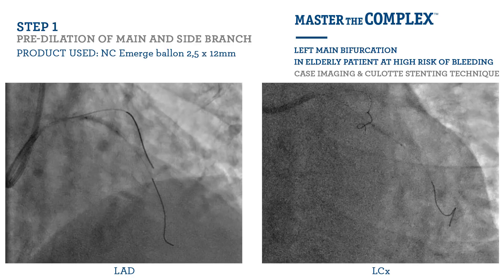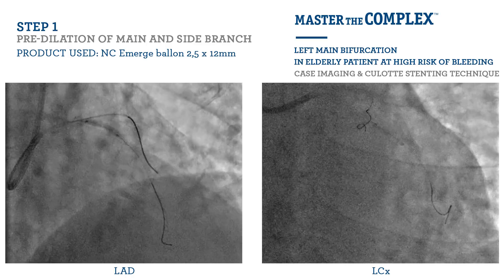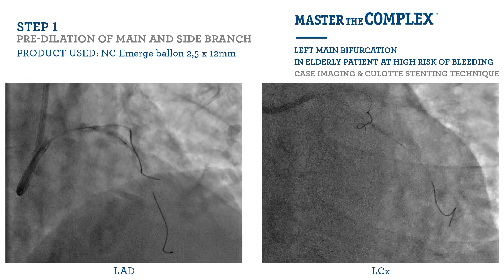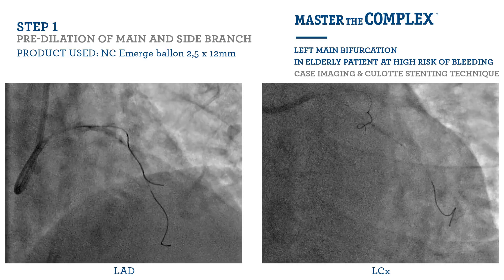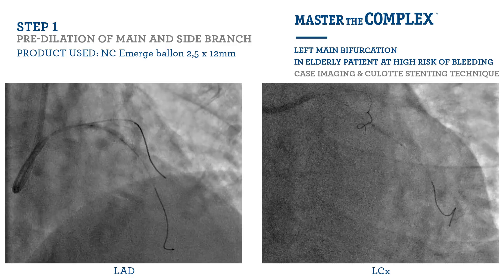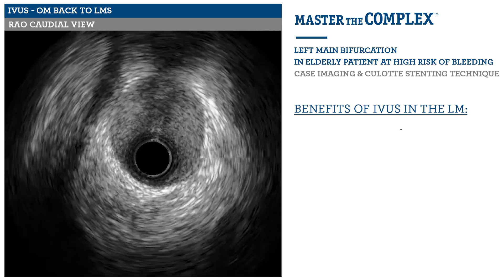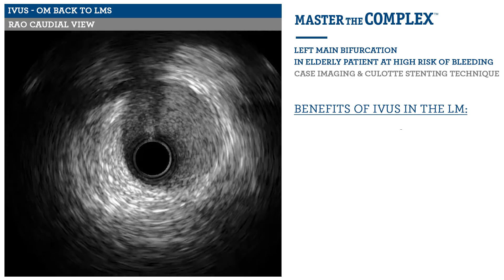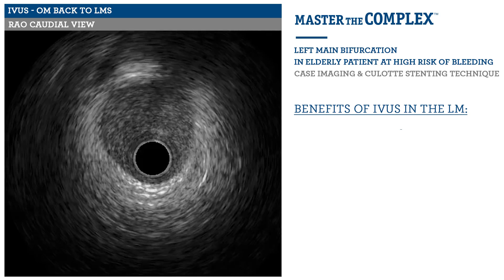We took an EBU 3.5 guide catheter and placed wires in both the LAD and the obtuse marginal arteries. The first step performed was to pre-dilate both limbs prior to intravascular imaging, using a 2.5 mm non-compliant eMERGE balloon given the calcified nature of the disease. Pre-dilation allowed us to pass an OptiCross 40 MHz IVUS catheter into the left circumflex and the obtuse marginal arteries.